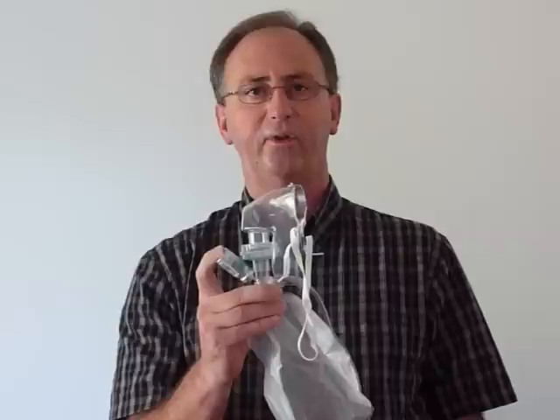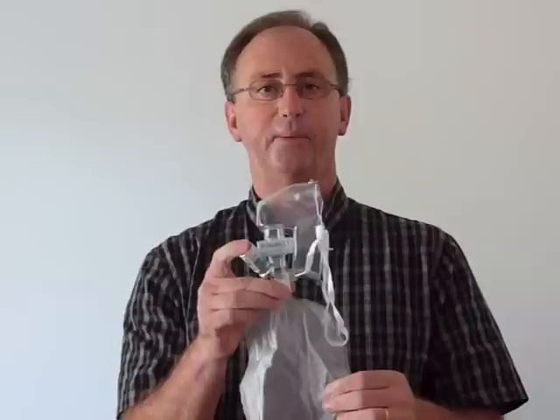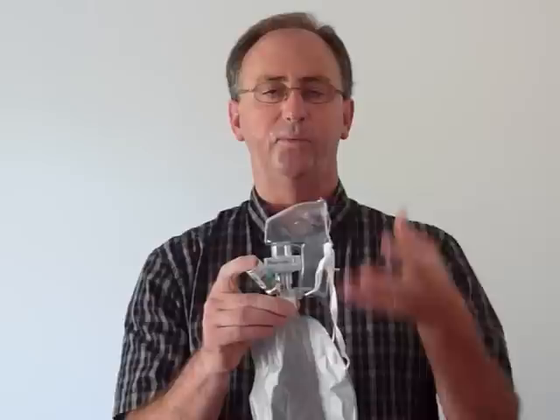It will only be for the patient. The last opportunity with this mask is if you need to give a drug-administered dose. You can put it into the injection port on the side, and the medication will go into the bag. Being a closed system, the patient would breathe in the medication with the oxygen you have attached to the mask.